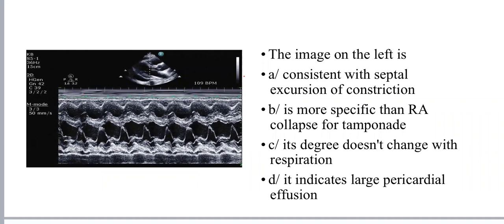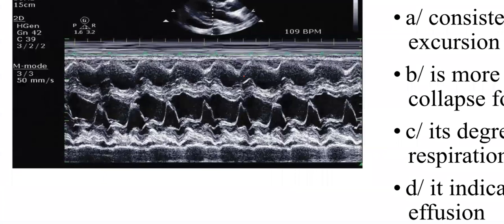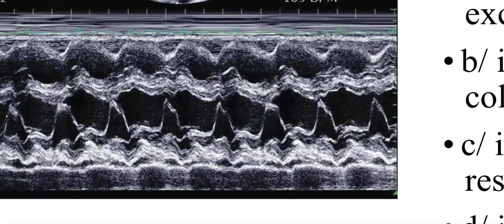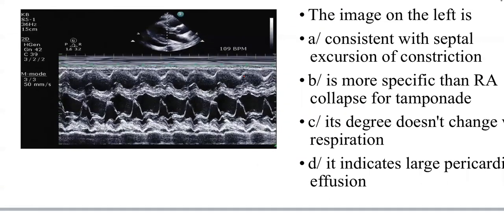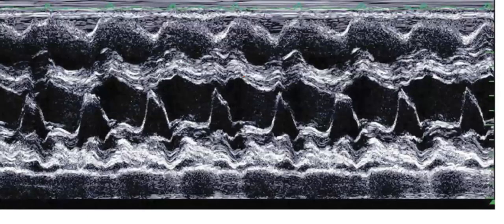It coincides with the E mitral. Okay. Let me see. This notching, I agree with you. There is notching in the septum. I agree. But is it constriction? The posterolateral wall is not flat, it is contracting as well. Exactly. If you allow me to draw your attention to the RV free wall. Look at the RV free wall.